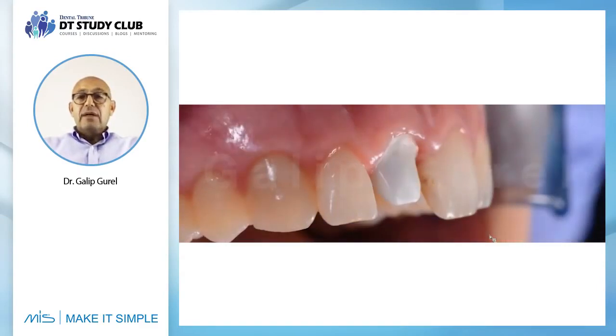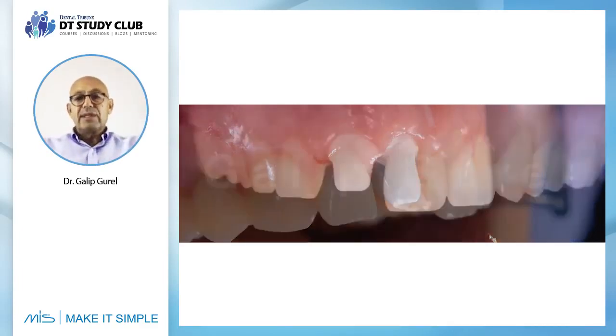In the lab, Mr. Taylan Sarı, who is doing this case, is choosing the abutment of choice with the highest value that we can use, for the simple reason that the more we add from a prosthetic point of view, the more porcelain we add on the crown, the lower the values go. So let's start with a high value and see what happens.